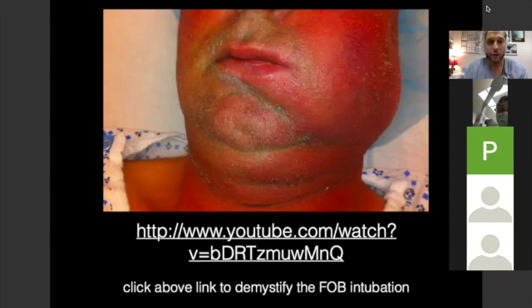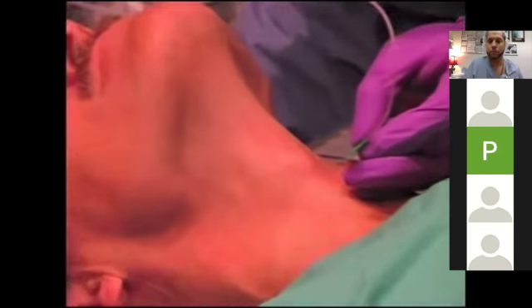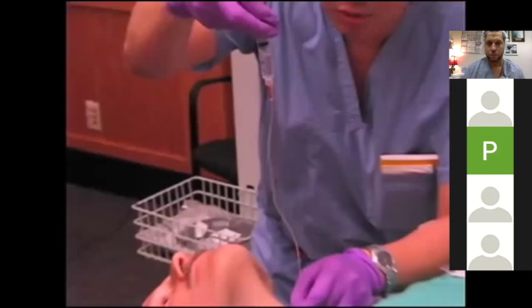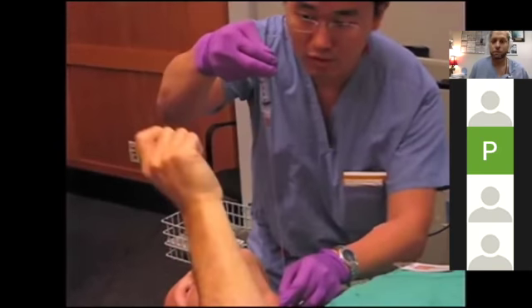So I want to show you this video of Michael Balin and how he really can simplify topicalization. So needle goes in, we just sit there for a minute, and well, 2 seconds. He'll withdraw bubbles slowly. And then just get the 3 cc's in and pull out.